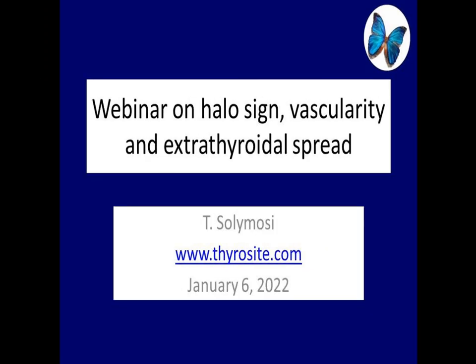This time we will speak about three features: the halo sign, the nodular vascularity, and the extrathyroidal spread.